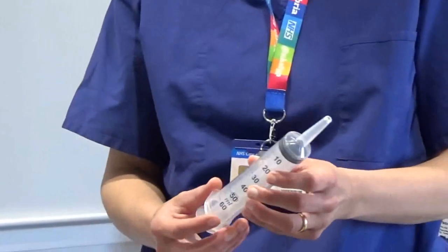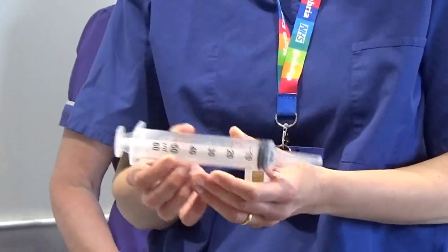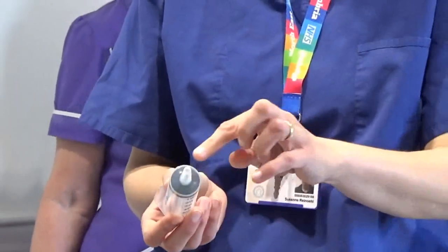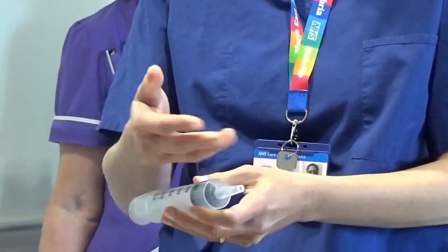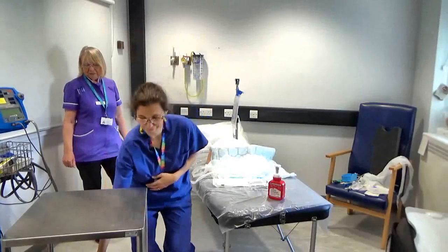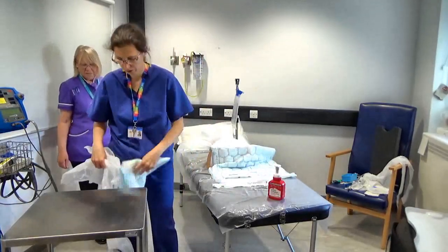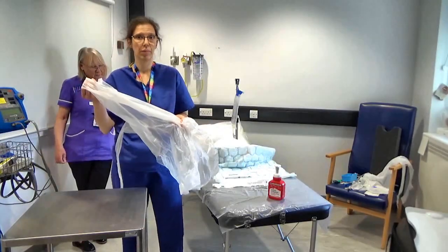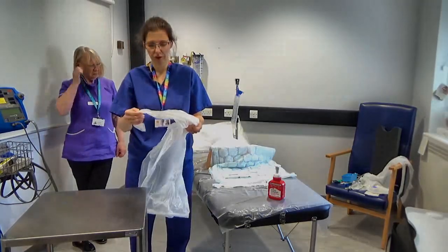It's important to have a catheter syringe around. It doesn't need to be sterile-packed but it does come sterile-packed as well. Look at how the tip looks — sometimes you need a little bit of suction to make the urine flow start, so it's good to have this around. You'll also need an incontinence pad to protect the bed, and you need an apron, which you can get from the dispenser on most wards.